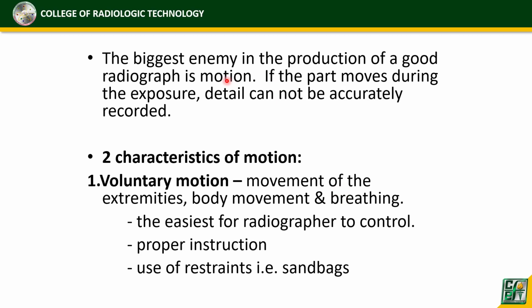So again yan, sabi nga natin, biggest enemy of producing a good quality radiograph is motion. Okay? So if the part moves during the exposure, so detail cannot be accurately recorded. So two characteristics of motion. Okay, so two types of motion.